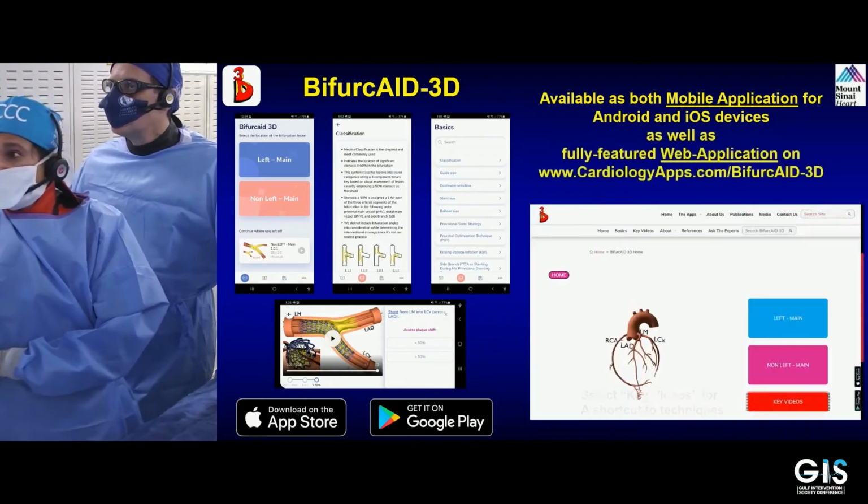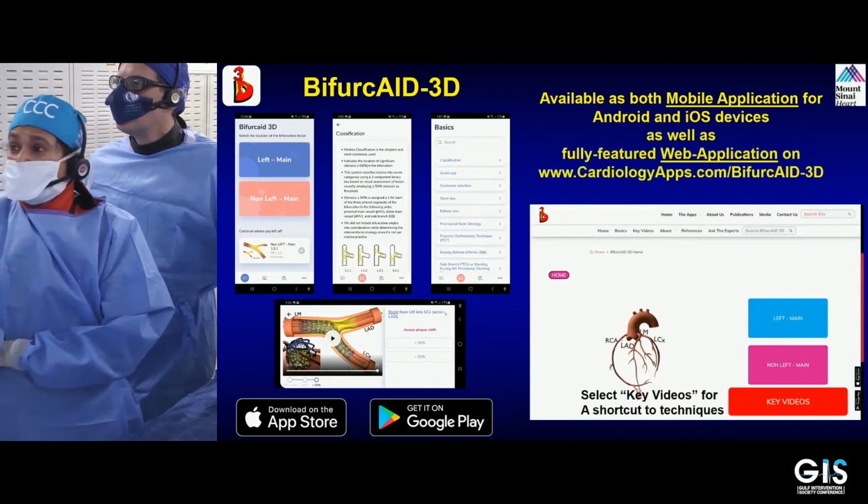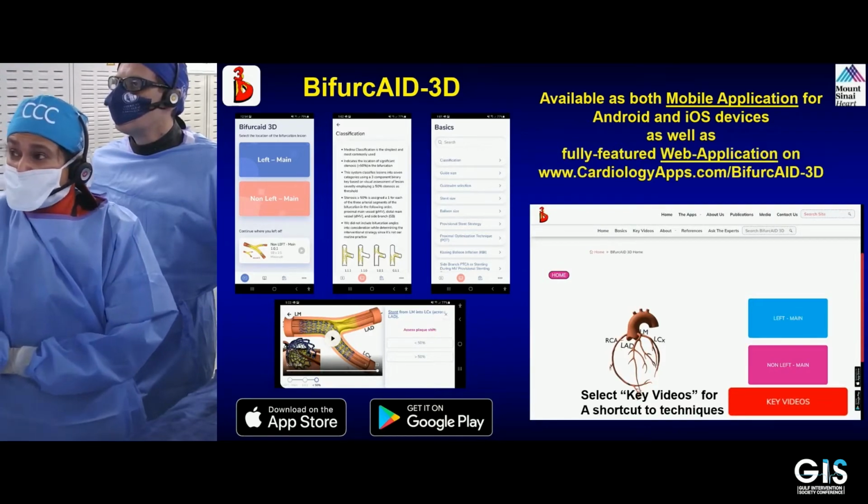Go ahead. Why is it not moving? Maybe we have a comment from Dr. Ahmed Khashaba, please.